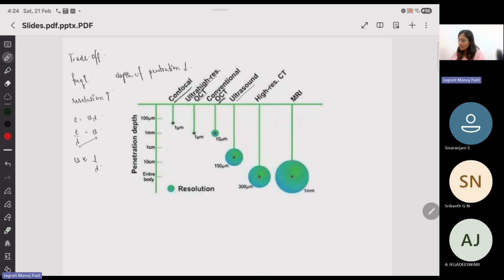And then you have ultrasound imaging. Ultrasound is again based on different frequency ranges. You have kilohertz imaging ranges, and then you have megahertz imaging ranges. Clinical ultrasound, what we have been looking at till now, is about 2 to 10 megahertz. But for therapy, people also go to a lower frequency ultrasound, and for high frequency imaging of superficial structures, they also go up to about 30 megahertz.